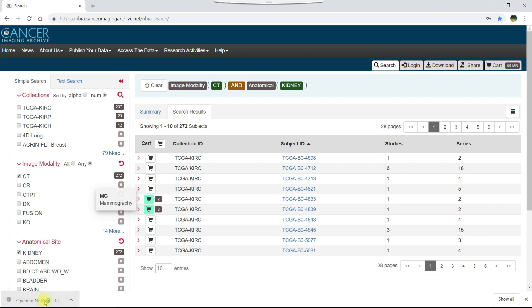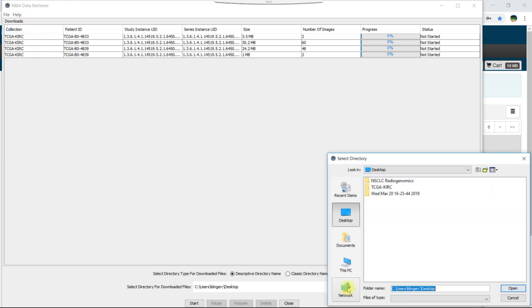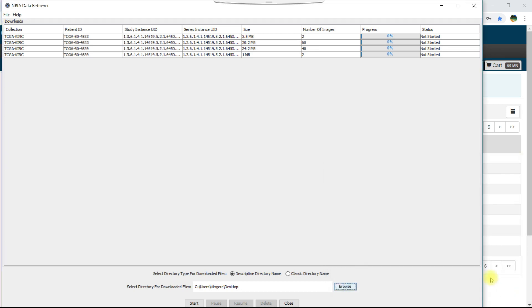Now let's click the manifest file to open it in the data retriever application. The items in your cart appear in the downloads table. To begin the download, first click browse and confirm the destination where you want to save the data. Then click start to begin the download.